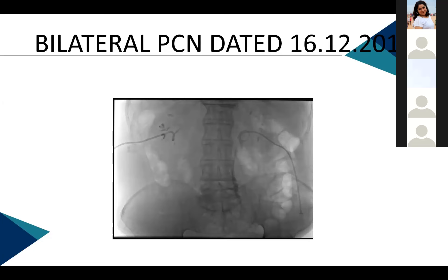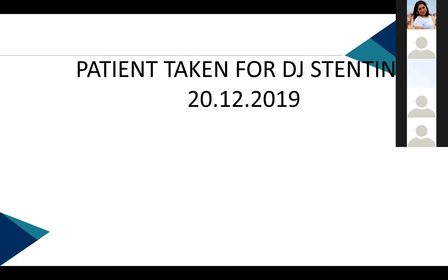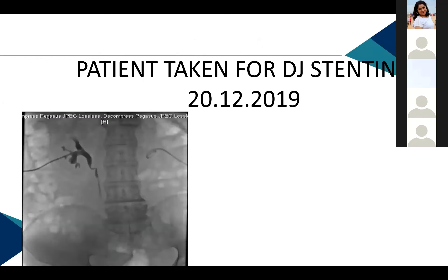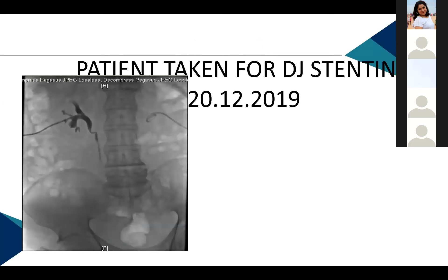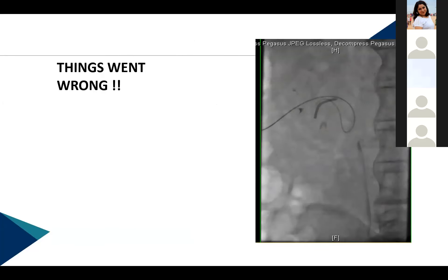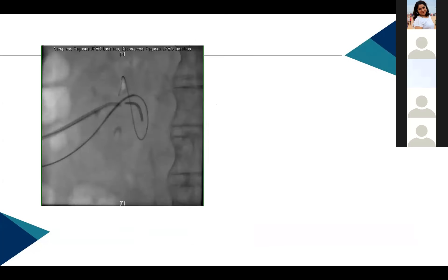Fluoroscopic image showed bilateral PCN catheters in place. The patient was then planned for DJ stenting. While exchanging the pigtail catheter over a stiff wire, the diagnostic catheter broke into the pelvic calyceal system. As the only person available, this created a panic situation. The initial PCN catheter was exchanged for a sheath and a new access was taken from the lower calyx.